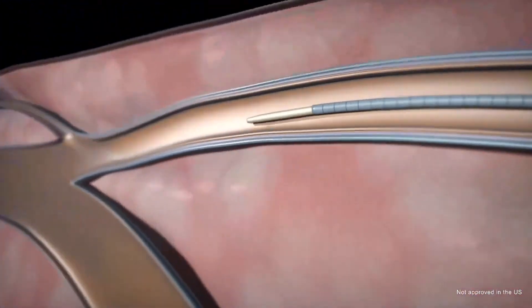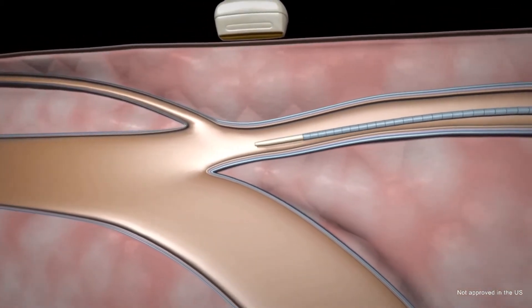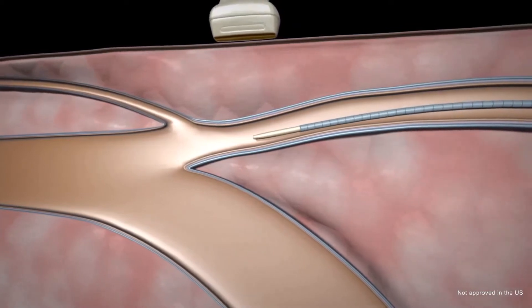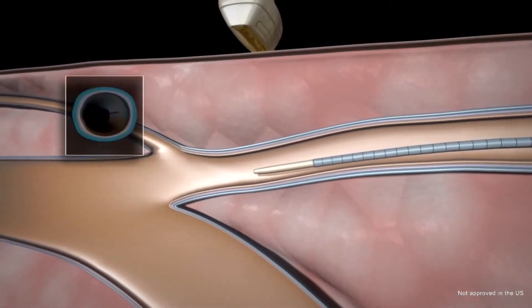The catheter is then advanced near the saphenofemoral junction, also known as the SFJ, which is in the upper leg. Under ultrasound guidance, the catheter is positioned appropriately just below the SFJ.